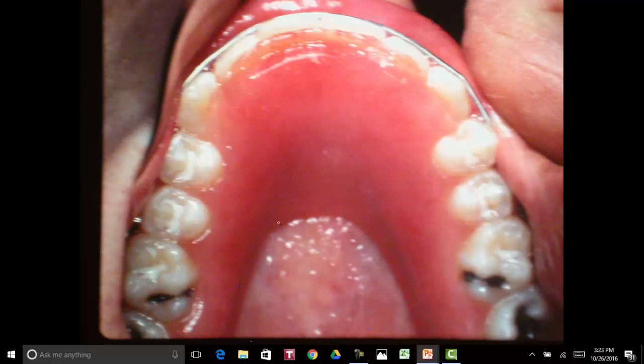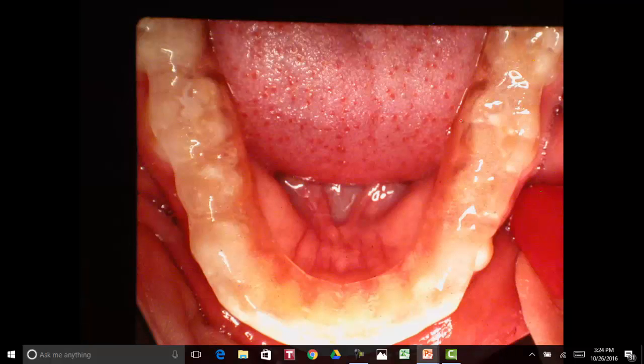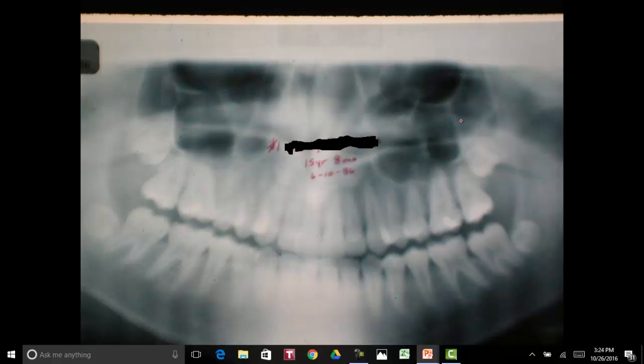This is her retainer. I don't like to have any wire in between the teeth because they tend to bite on the wire and the teeth aren't allowed to erupt into each other. We put a bite plate on everybody to hold the bite at the correct position. She had a little bit of a deep bite but not a big problem. We brought her jaw up and kept it comfortable. Here are the panorexes — she was 15 years and 8 months, which was in 1986.